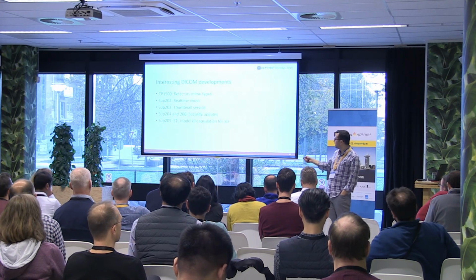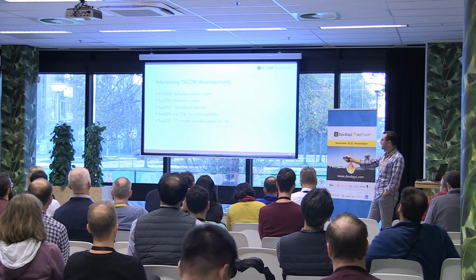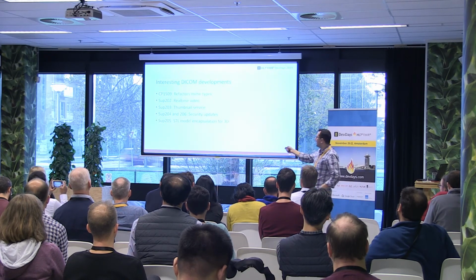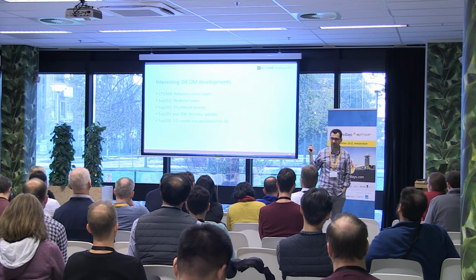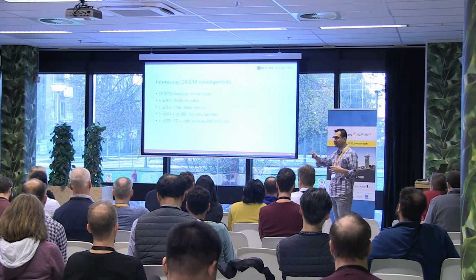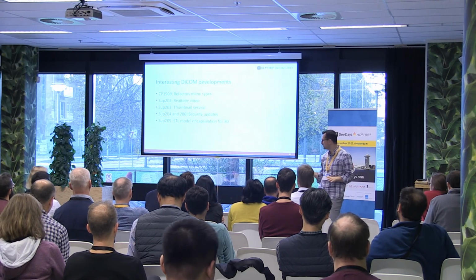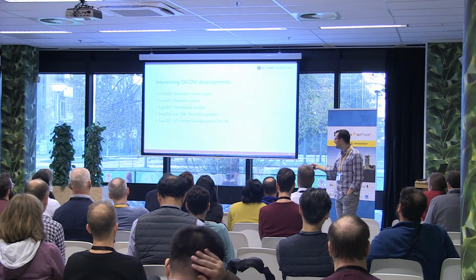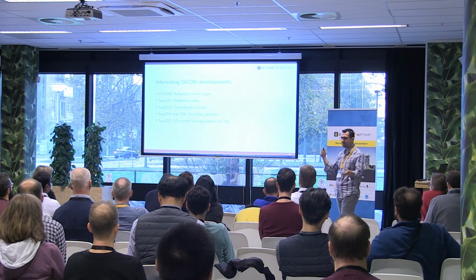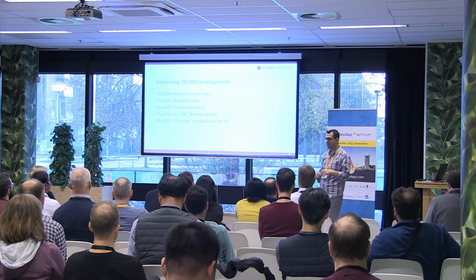Similarly, within DICOM, there are interesting developments for anybody that wants to dive really deep into DICOM. So some MIME types have been refactored for how you ask for images. Real-time video just came out. This is very interesting. So real-time video would be like surgery being performed, and you can actually broadcast it live, not on Facebook, but within the hospital. Just don't get any ideas, people. Thumbnail service, I talked about that very quickly. Some security updates. I mentioned this one just because a lot of people have seen the video on YouTube where somebody went in and plugged the device and hacked a scanner.